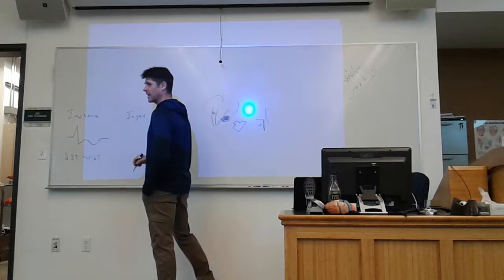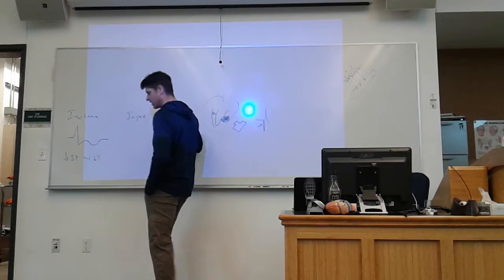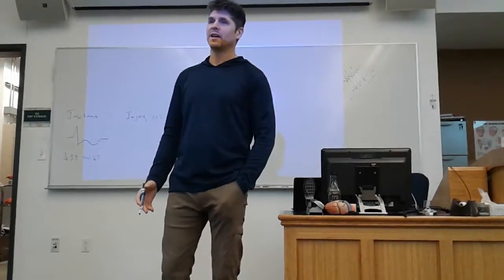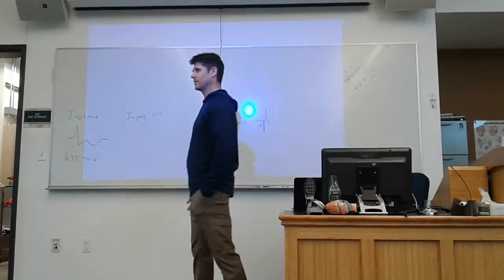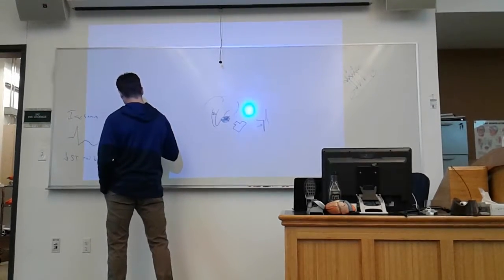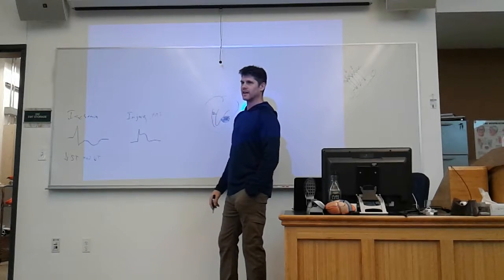Injury, and when we say injury, we're saying an acute myocardial infarction. What does acute mean? Happening now. Right? We often abbreviate things as just MI. Hey, they're having an MI. But they're not just having an MI, they're having what kind of an MI? An acute MI. They're having an MI right now. So it's acute. With that one, we see elevations in our ST segment.